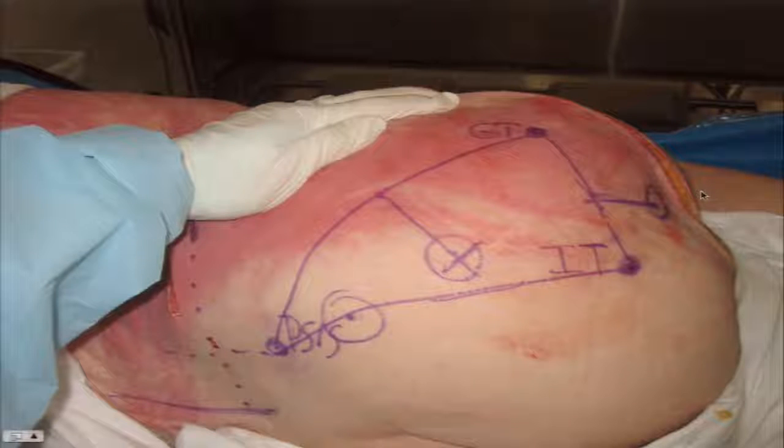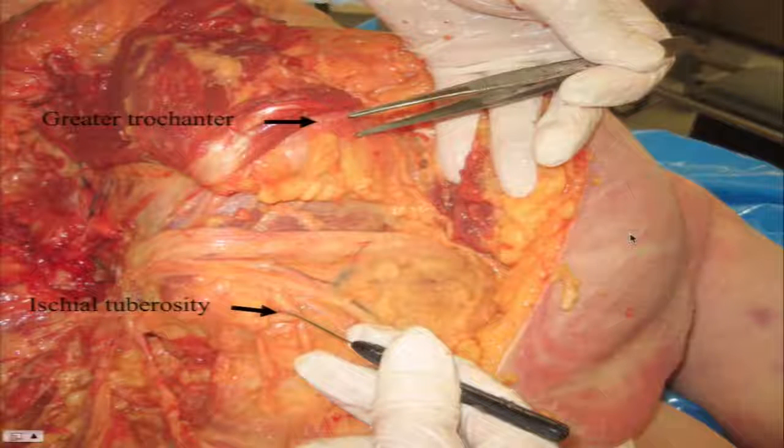This is a cadaveric specimen. We've mapped out the classic Labat approach landmarks with the greater trochanter as well as the posterior superior iliac spine. Also, the subgluteal landmarks have been marked out here, pretty much bisecting the middle between the greater trochanter and ischial tuberosity. From there, we've reflected this cadaver, and we have the greater trochanter as well as the ischial tuberosity.